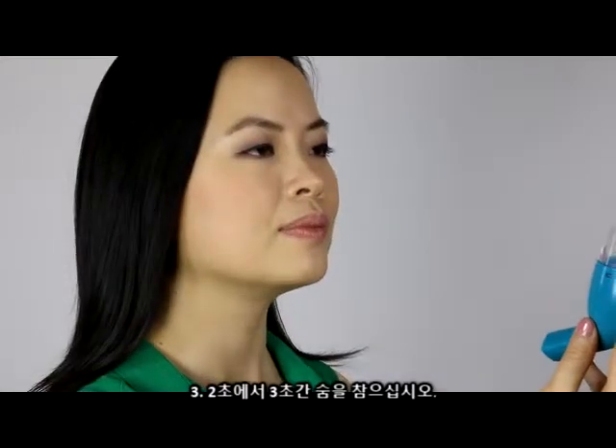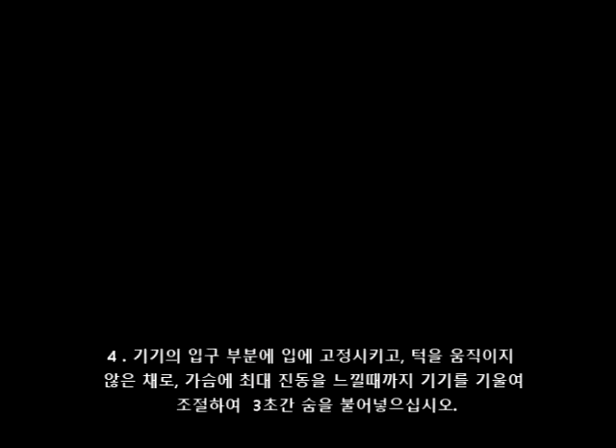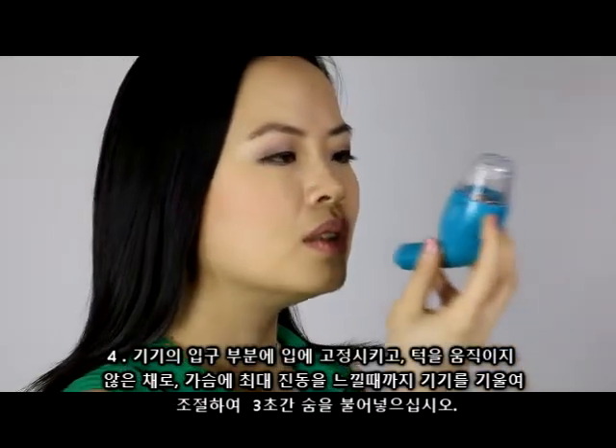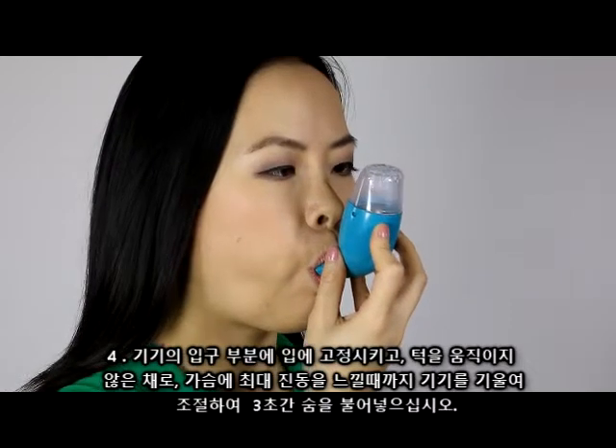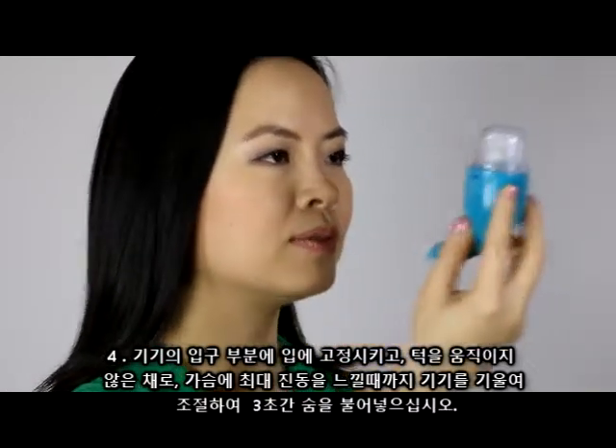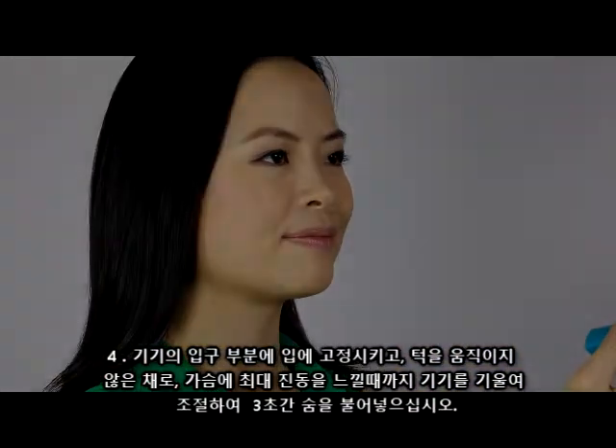Step 3: Hold breath for 2-3 seconds. Step 4: Place the device mouthpiece into your mouth. Breathe into the device for 3 seconds while adjusting the device by tilting it until you feel the maximum vibration within your chest, keeping your cheeks stiff.